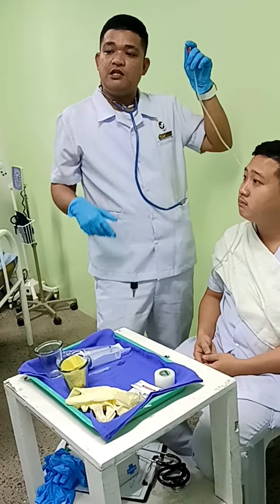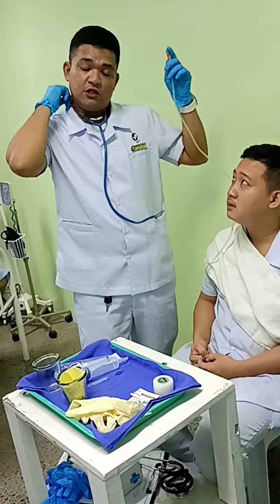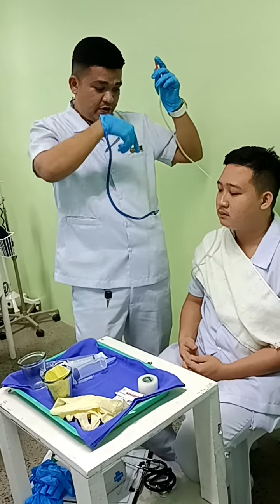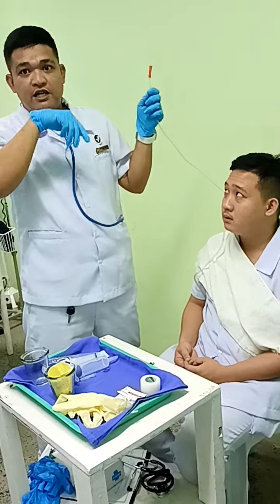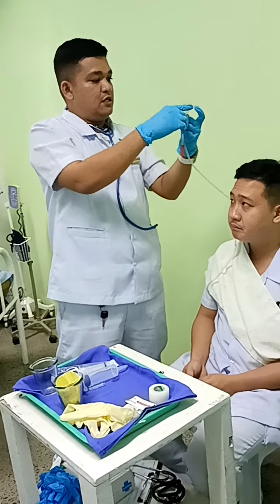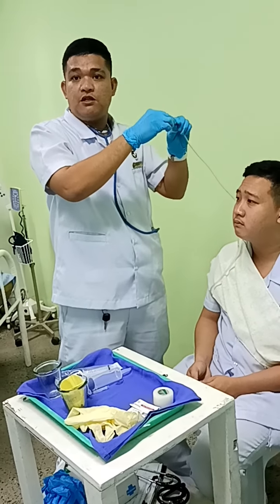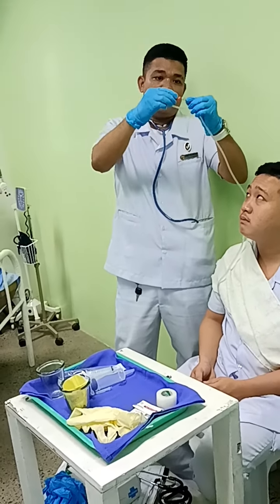So if there are any prescriptions from the doctor that the patient needs to undergo X-ray, we also have to prepare the patient as well. So for the next step is to clip and cap the end to avoid cross contamination. So it goes like this.